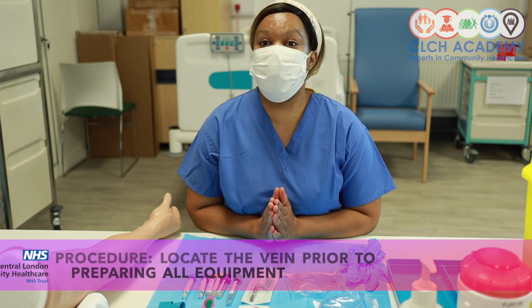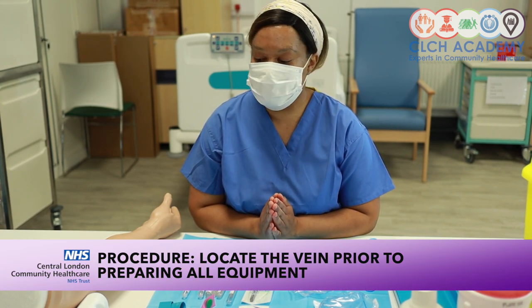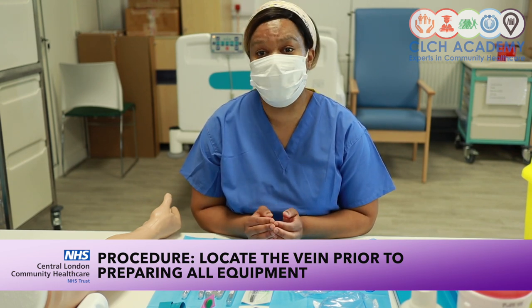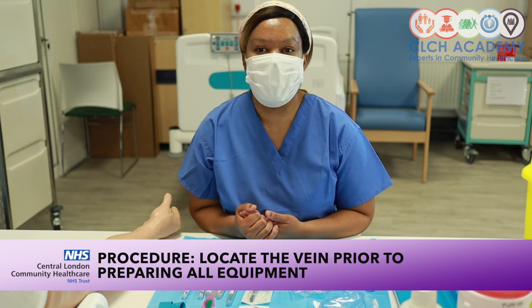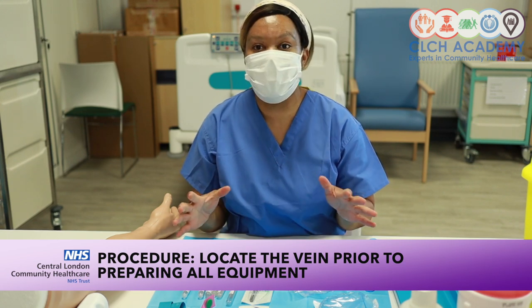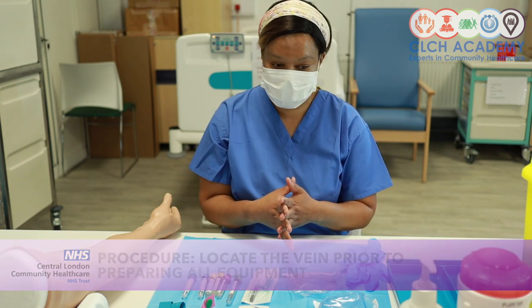First things first is you will risk assess. So maybe the key aspect I will always highlight is make sure you can actually access a vein for a patient prior to equipment preparation, because you could go prepare all your equipment and then discover actually you don't have a vein that you can access. And that would just mean that all the equipment that you would have prepared goes to waste because you cannot use that at that point in time.